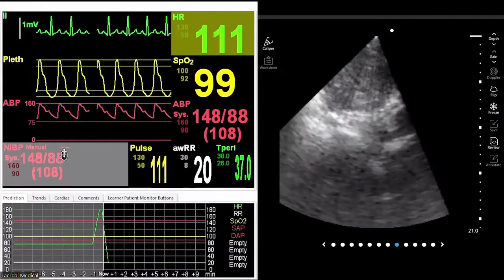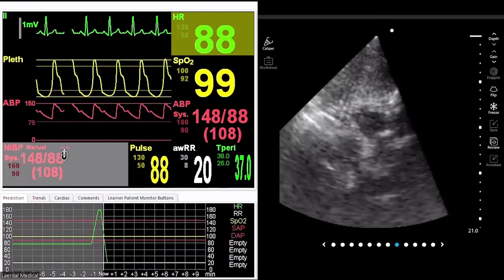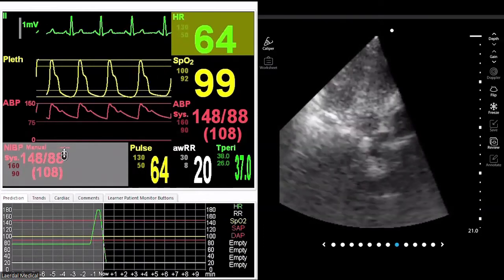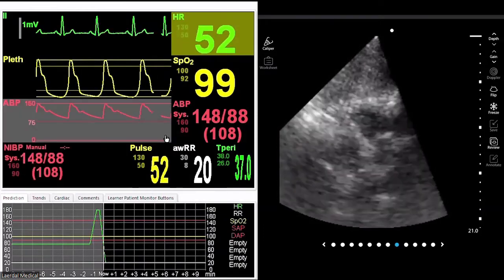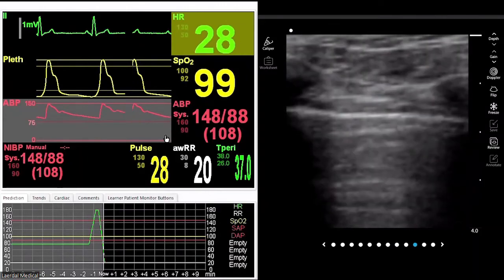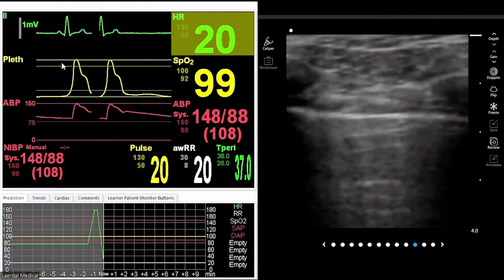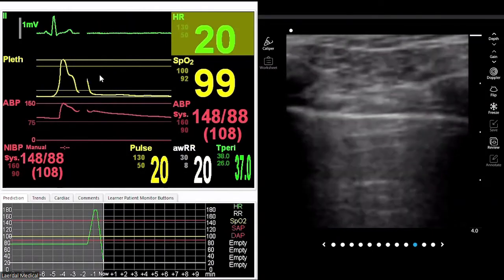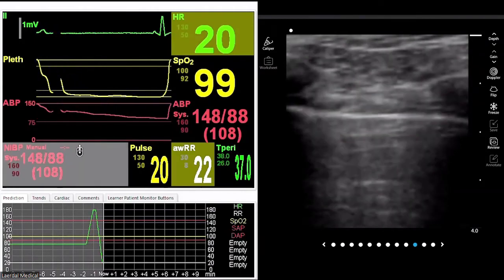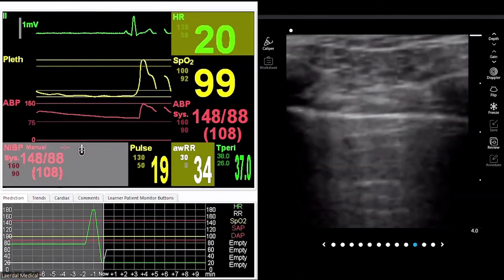Okay, so now let's have an example of the respiratory rate. With the respiratory rate, obviously we'll see sliding. If I acquire the image now, we can see we have a respiratory rate set of 20. Now if I go to the Leap interface again and select that numerical value, let's take that up to around 60. This time we'll do it over 20 seconds and select OK. Now when we acquire the image, we'll be able to see the lung sliding go from a rate of 20 up to 60 over the selected period of time.